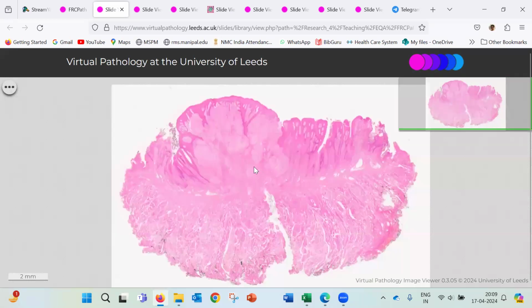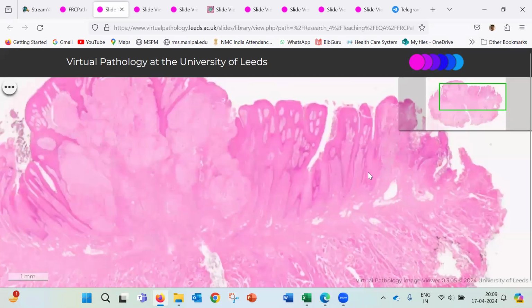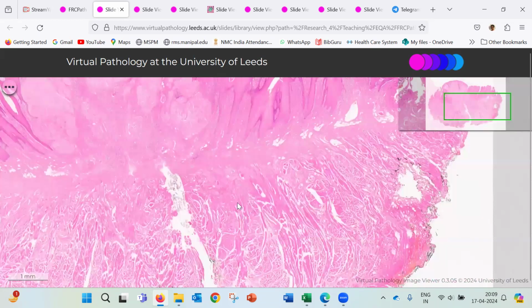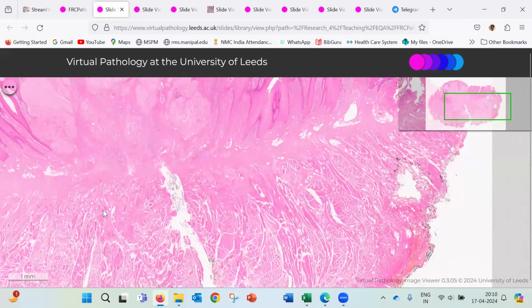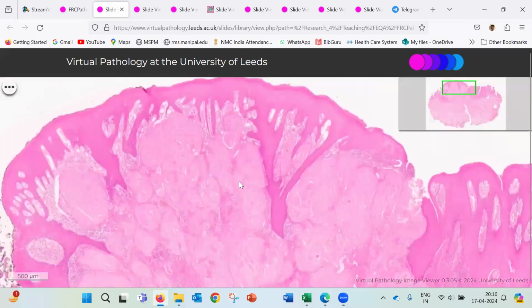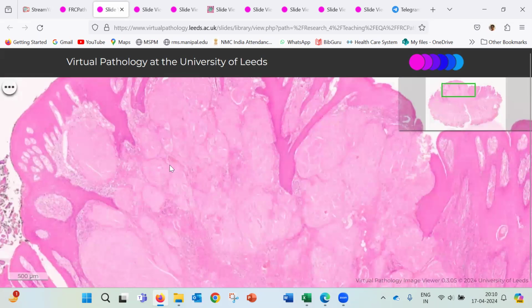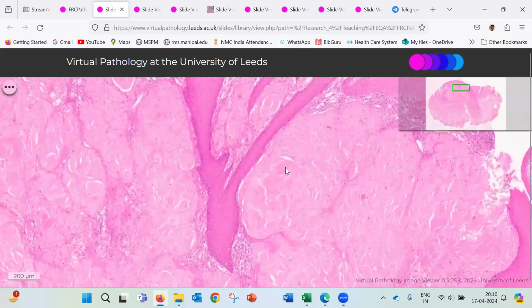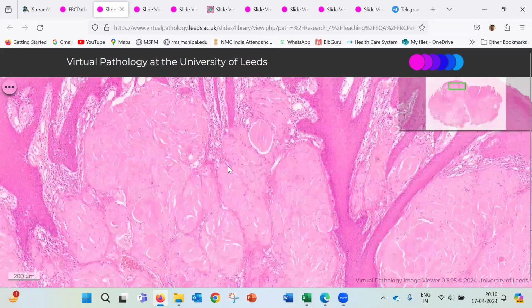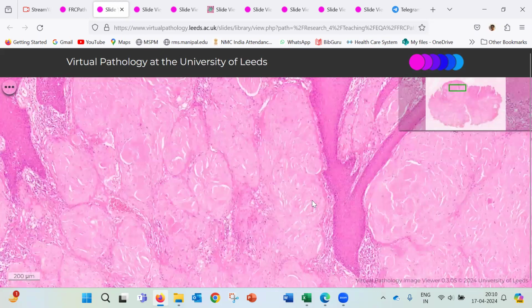If you see that the lining epithelium is thrown into papillary folds, and the underlying musculature, the resident intrinsic muscles, are all okay, but under the epithelial lining you see this kind of eosinophilic homogeneous material which has this very characteristic histological artifact known as cracking artifact. It is a case of amyloid tongue.